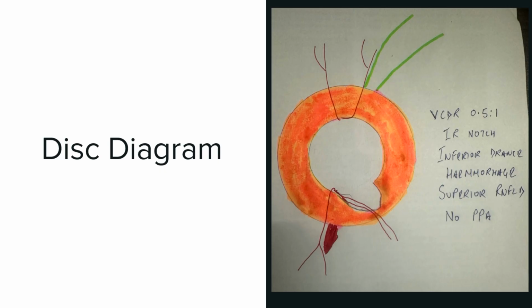What is missing there? What should be there? One more thing: shape. If you have a notch there, what else should be there? There should be another RNFLD inferior-temporally corresponding to that.